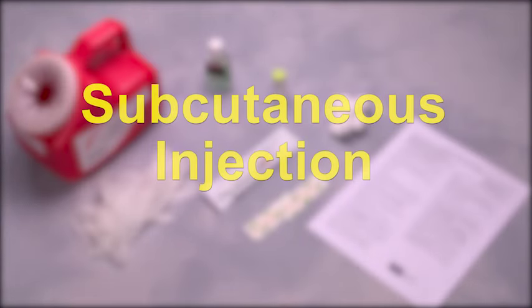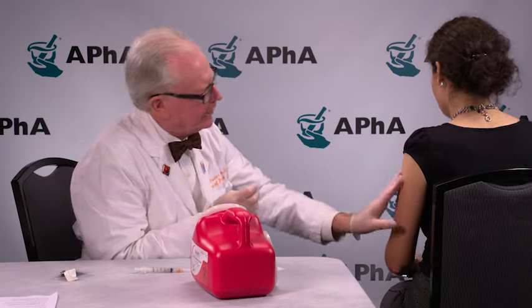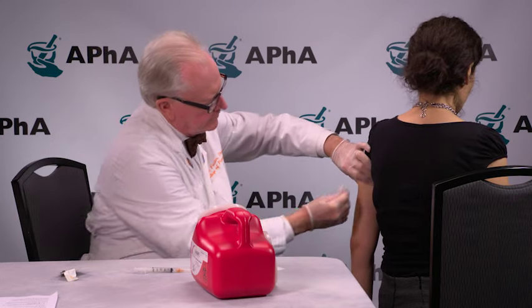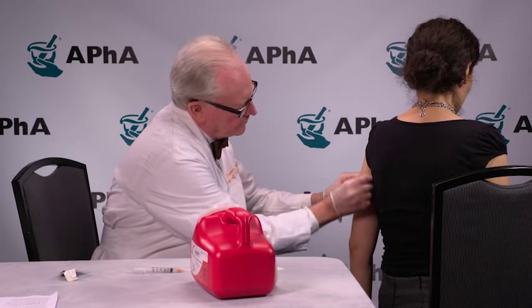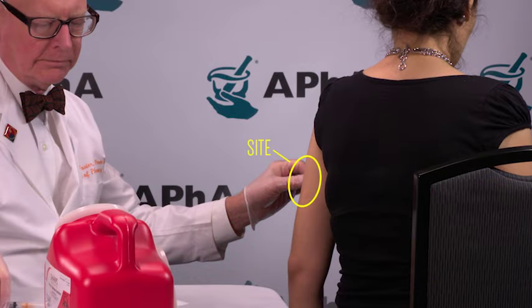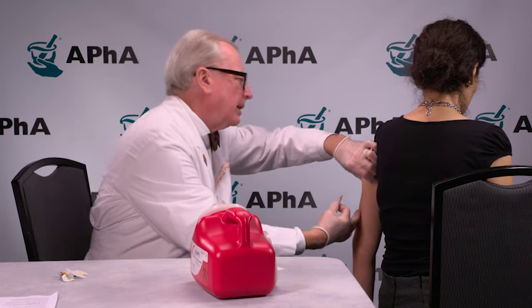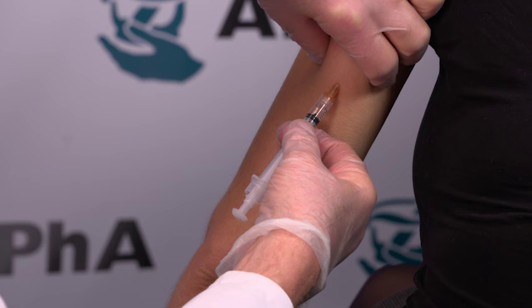The following is a demonstration of a subcutaneous injection. Once you are ready to inject the vaccine, proceed as follows. Be sure both you and your patient are seated. Expose the injection site, which is on the posterior lateral aspect of the upper arm. Swab the injection site with alcohol and allow the alcohol to dry. Note that the sharps container is readily accessible. Hold the syringe near the hub. Pinch a fold of skin and insert the needle at a 45-degree angle to the hub of the needle. Maintain contact with the patient at all times.